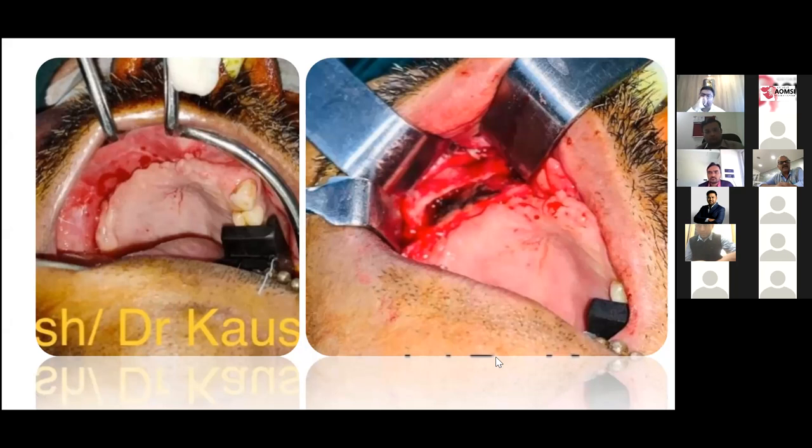If I have to put two zygomas with the opposing teeth present, it becomes a real challenge, right? Wherein I compromise either with the angulation, or maybe I end up only placing one zygoma and then I have to think of placing an implant diagonally above the roots of the teeth on the opposite side or something like that. So this is one specific place where I think that PSI has a better role to play if we have encouraging results from that. I think we would like to have Nihal's opinion on that.